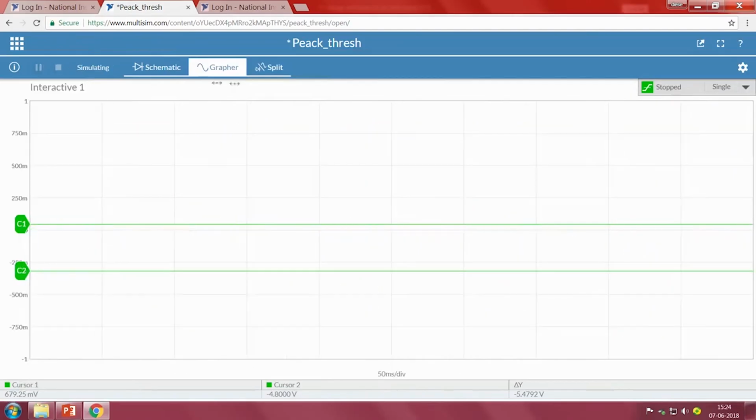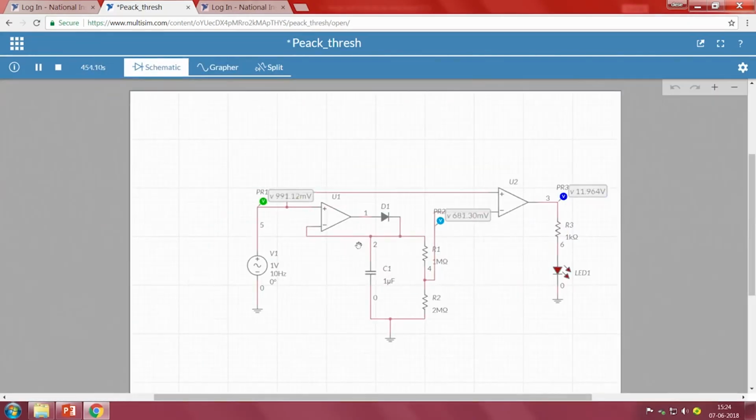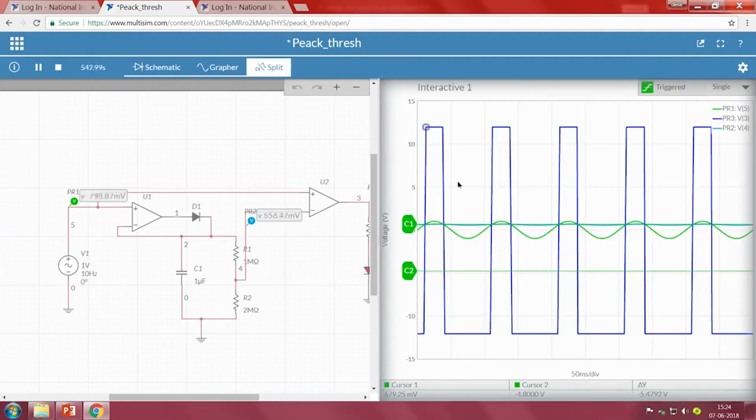So grapher, now see what is happening. Yes, when we observe, C1 is at what point? C1 is at 679 millivolts. So we require 666. Now when we see, the output is becoming higher only when the input is greater than this particular threshold. Now what is the other color behind the C1? That is our blue color, that is for the threshold. So here if you remember the schematic, we have used one at this point, other one is at this point, light blue, sky blue and dark blue. So here if you see, this is the output and the sky blue color is somewhere here. So that is our threshold, right.